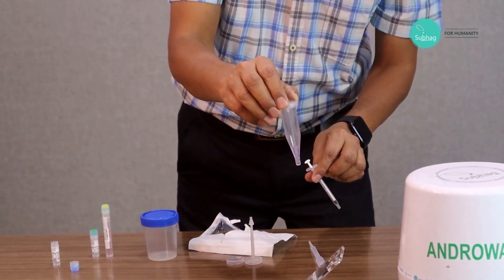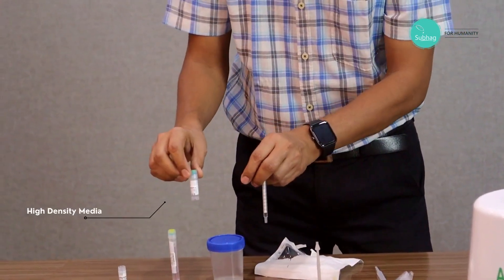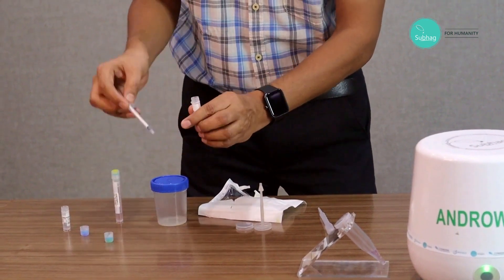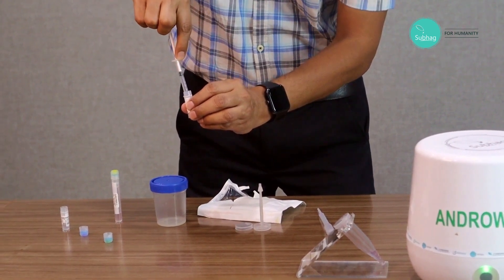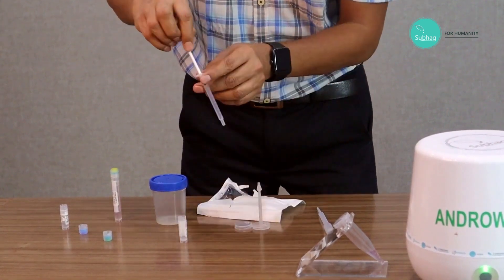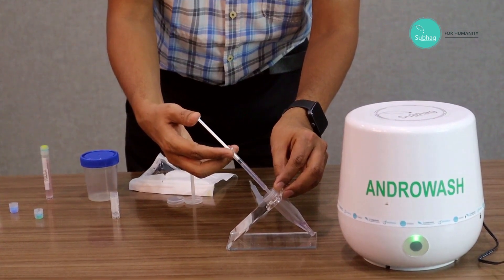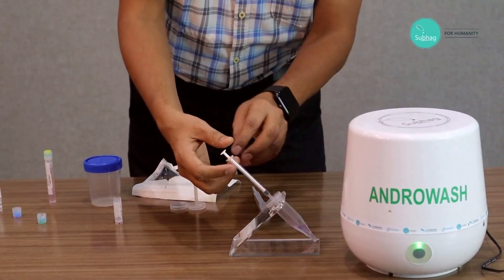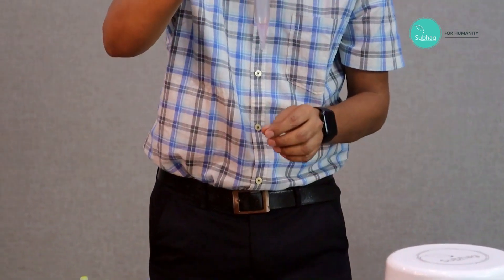So the low density layer is done. Then we take the higher density media. Here also we take the entire volume at a time with the help of the syringe. We take the full quantity and again attach it with the cap hole and simply inject it. No need to bother about at what speed you are doing it — so anyone can do it without any prior training.